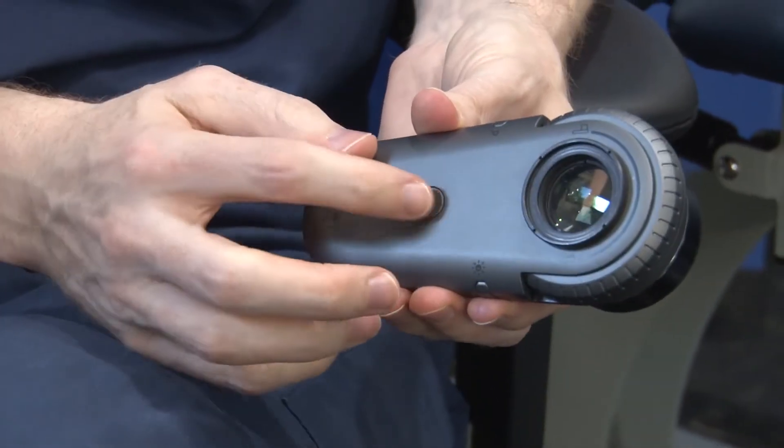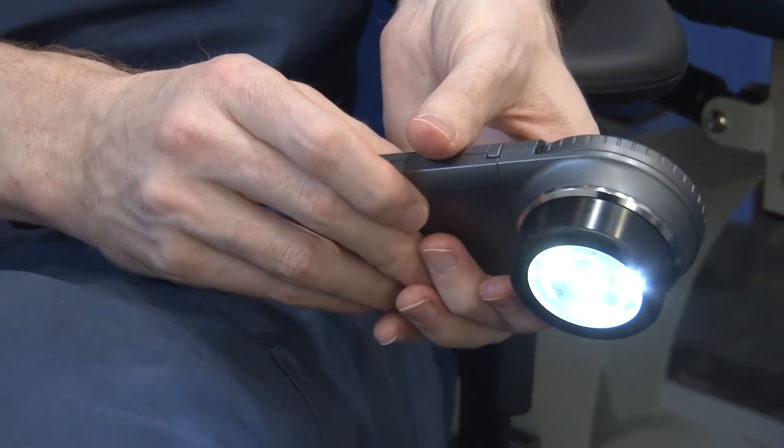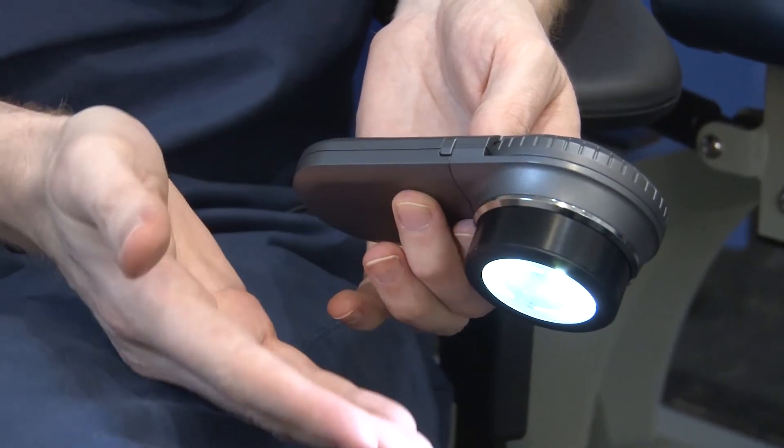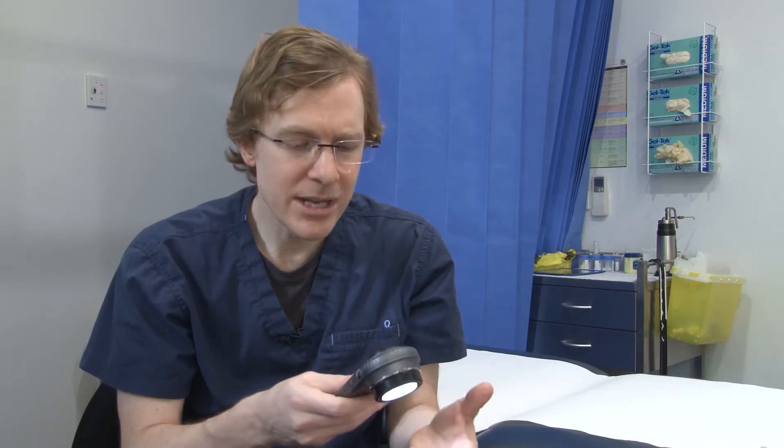As you'd expect, a power button happens to be on the top here. Lots of LEDs, a nice white light — quite a nice, neat, clean white light. Some dermatoscopes have more of a yellowness to them. The light works for two hours of operating time, so it's not like I recharge it between sessions.